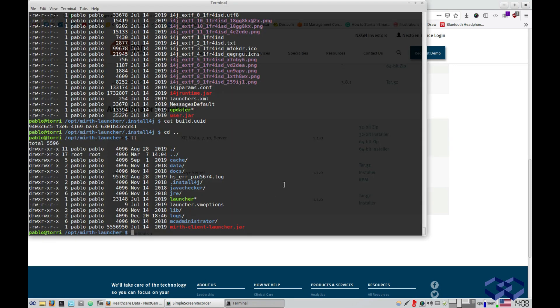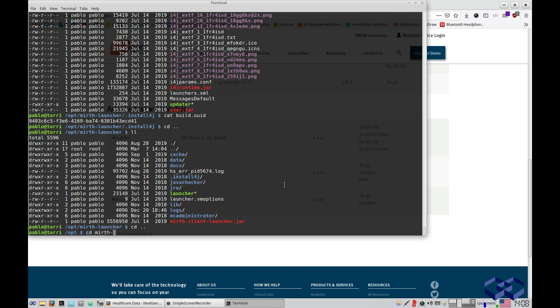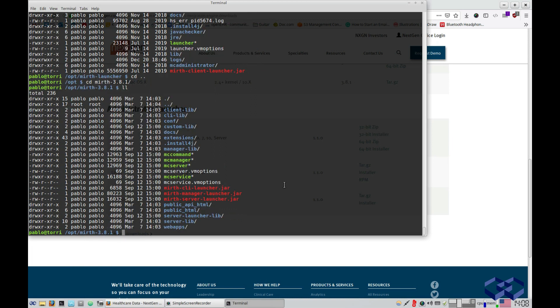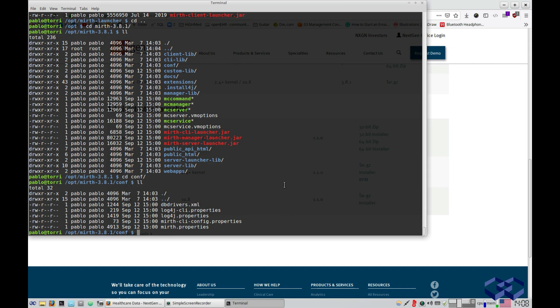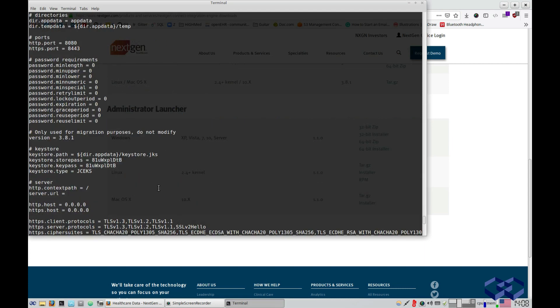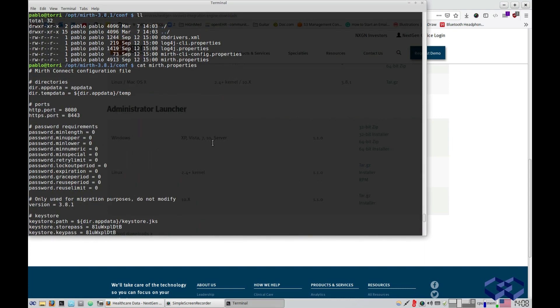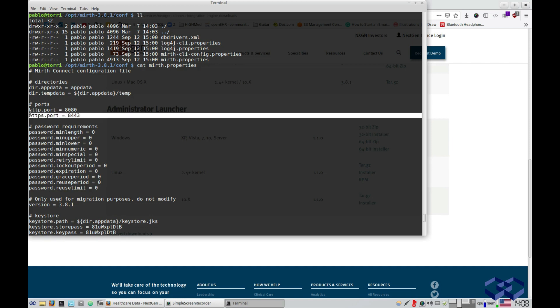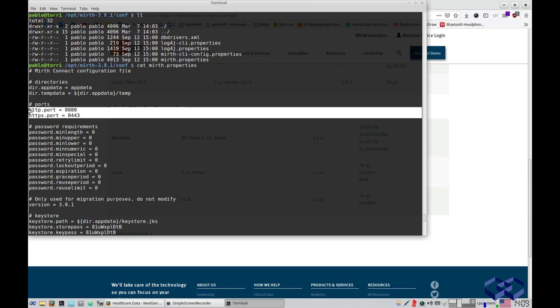The second step: go to the folder where MIRTH Connect is installed and open the config folder. You will find a configuration file called mirth.properties. The first thing you need to do after downloading and extracting the compressed file is you might need to change the port numbers. There are two ports: the web port, which is 8080, and the secure administrative port, which is 8443. You may need to change those if you are already using them.